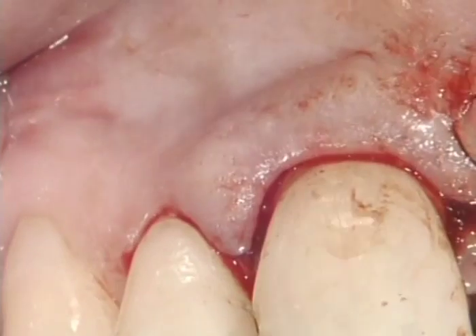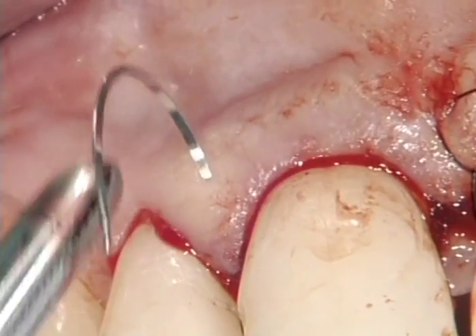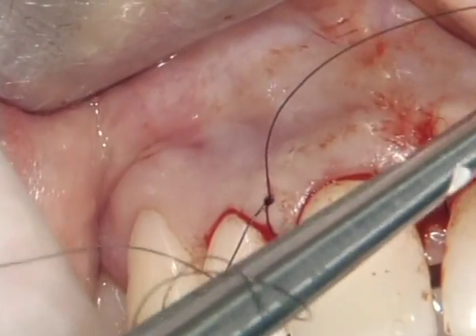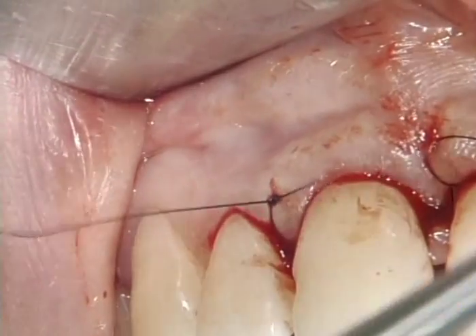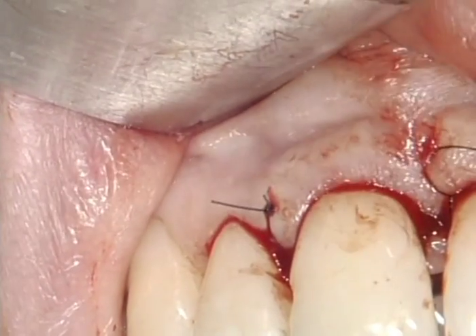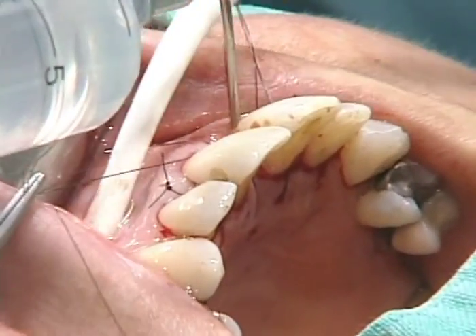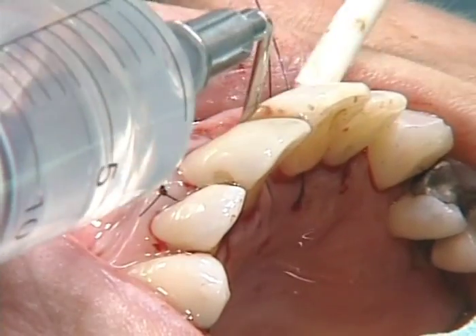The thread end is again retained using a little mosquito. The other end of the extension incision is sutured with the same 5-0 suturing material. To get rid of any remnants, the area is rinsed with sterile saline solution.